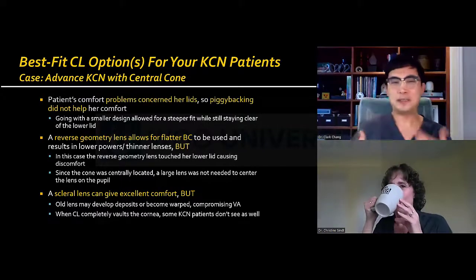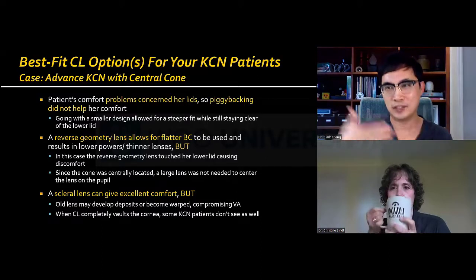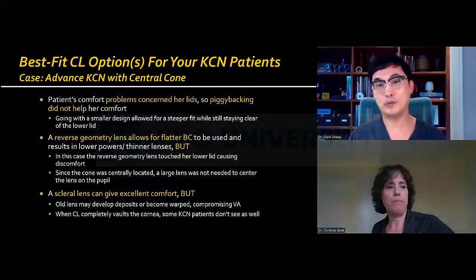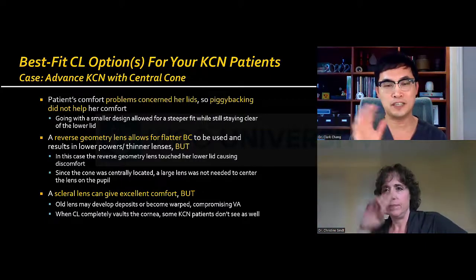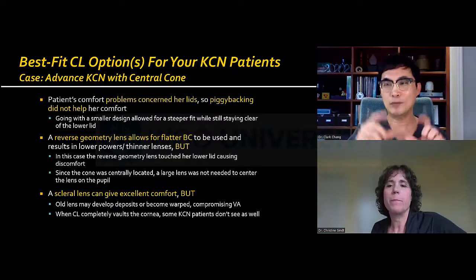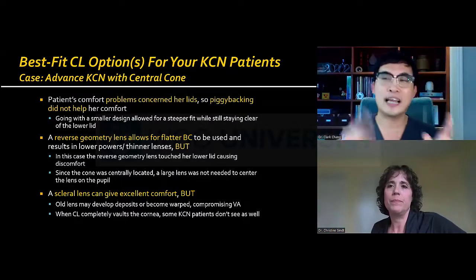But yes, piggybacking is not going to help the patient with the lid discomfort and the interaction of the edge hitting the lid margin. Sometimes, though, depending on how you alter the GP fit, if you do a piggybacking, provided a soft lens can stay on the eye, it will reposition the GP lens as well. And so that is a possibility.